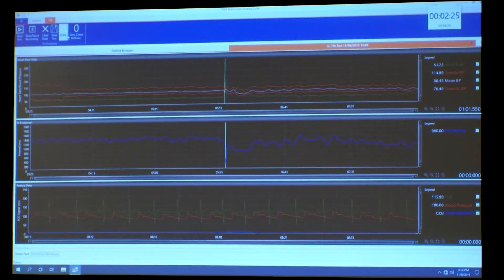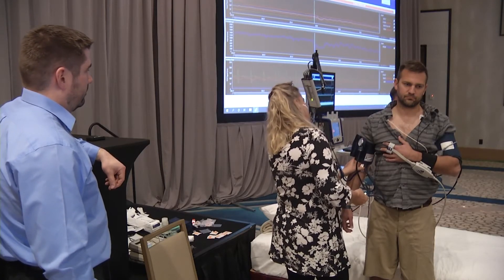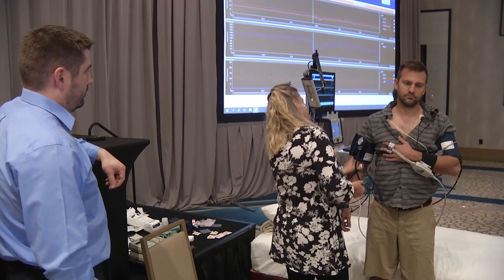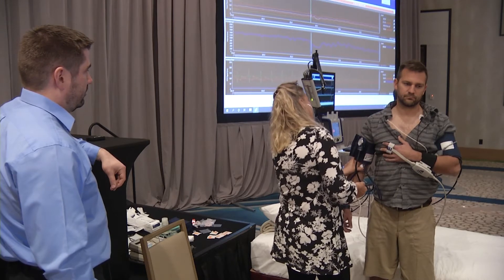Some want blood pressures every minute, others don't. If the patient is stable, we might skip one — for example, during a ten-minute tilt, if they're stable at five minutes with no change, there may be no reason to take that blood pressure.